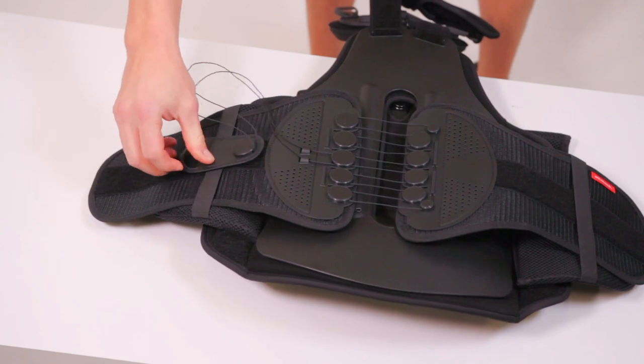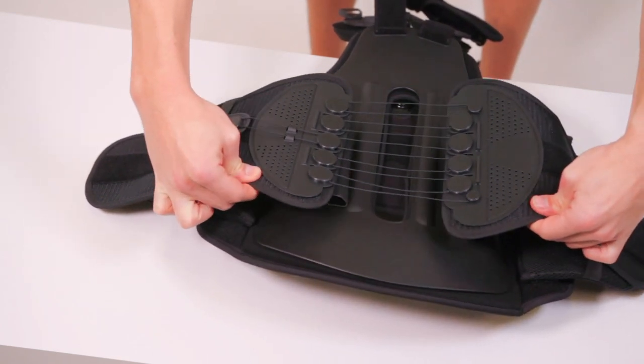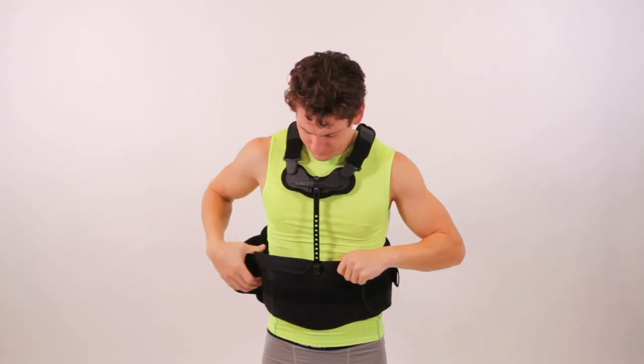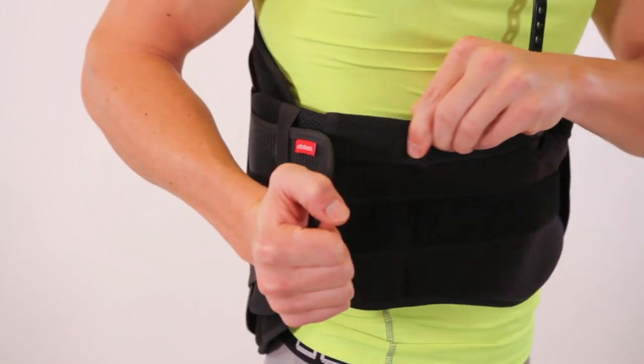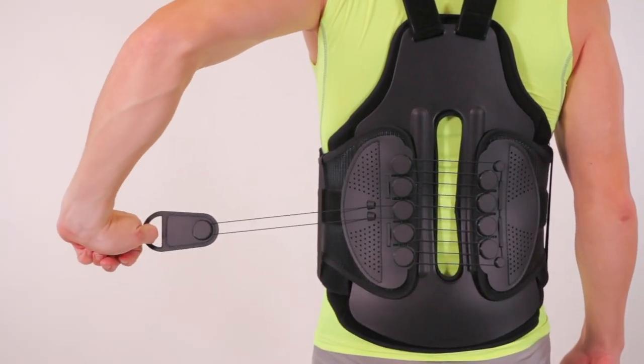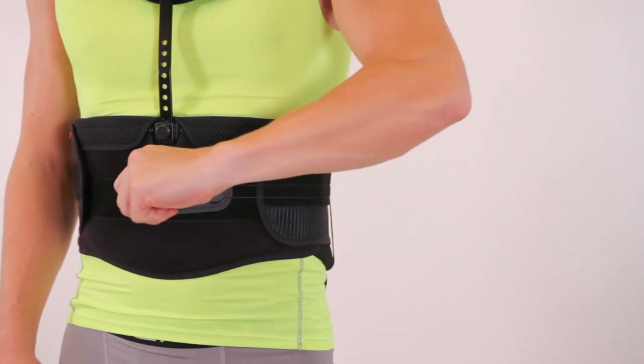Fully loosen the pulley system, then pull the device over your head like a shirt. Attach the remaining side of the back panel to the front panel. Remove and extend the pulley system until the back panel feels snug but not too tight.